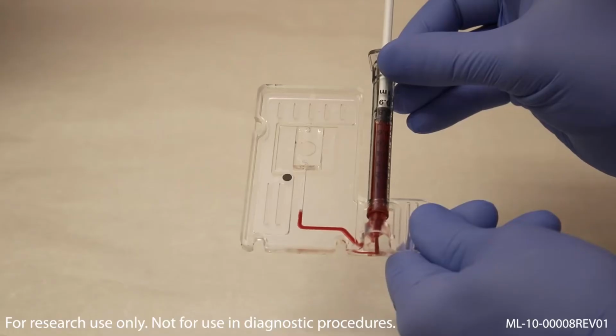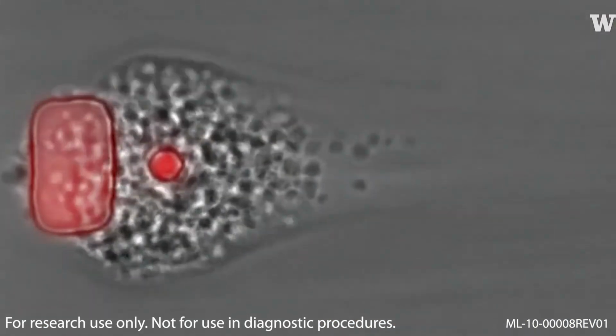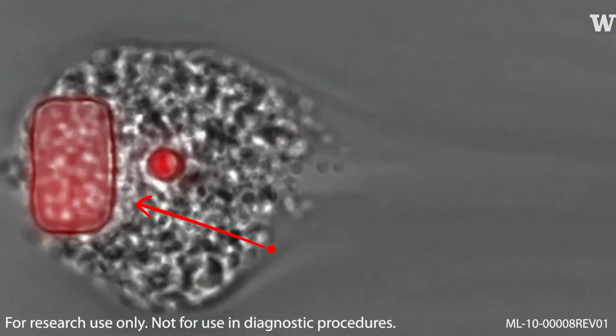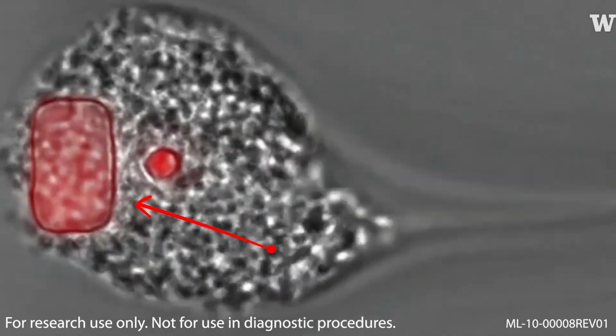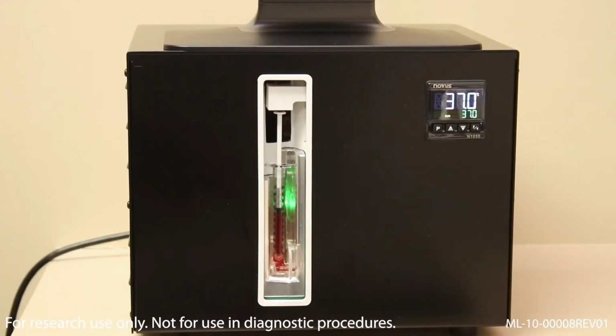As a blood sample flows through the microfluidic sensors, platelets are activated by the shear and aggregate to form a platelet plug. As the plug contracts, the post is pulled towards the block and against the direction of the flow, and platelet strength is measured by the degree of the post deflection. After initiating the test, the Atlas PST instrument automatically depresses the plunger on the syringe to inject whole blood through the card and across the microfluidic sensor.